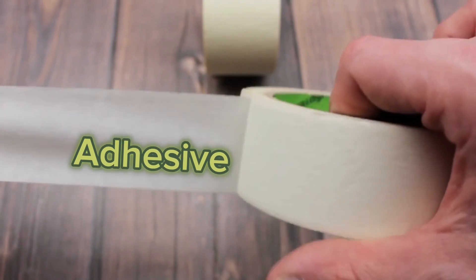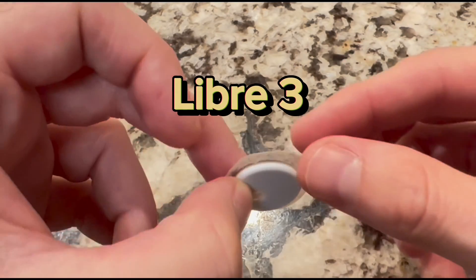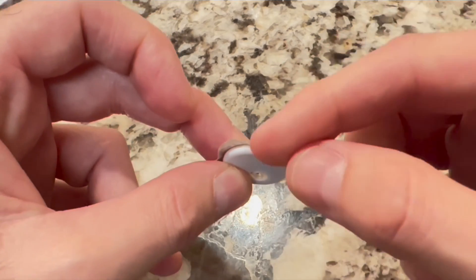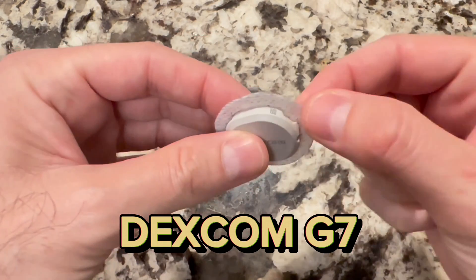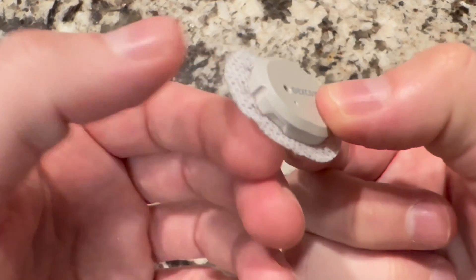What about the adhesive? This is another important area for all CGMs. The Libre 3 adhesive appears fairly thin and not very wide — the consistency is more paper-like rather than a cloth material, likely in an effort to keep the sensor very small and thin. The Dexcom, on the other hand, has a thicker adhesive with more of a mesh-type pattern, similar to what you'd find in a band-aid. Adhesive worked really well in both, and while I feel the Dexcom G7 adhesive is superior, I didn't experience any issues with either sensor falling off prematurely.